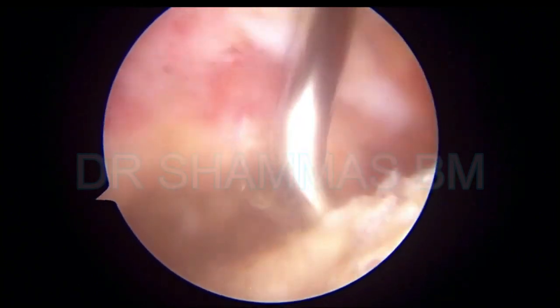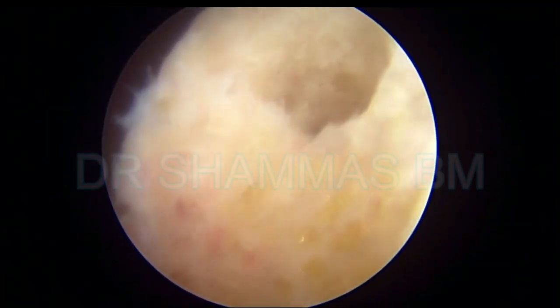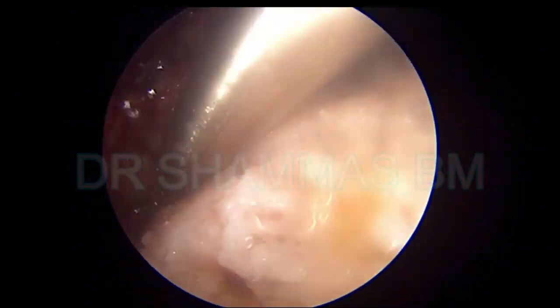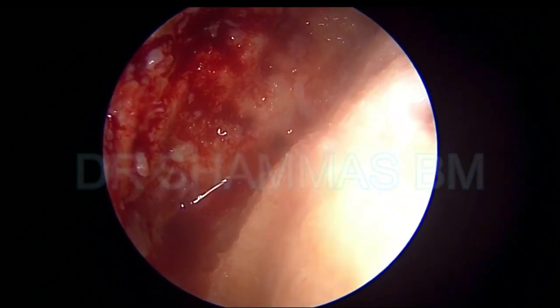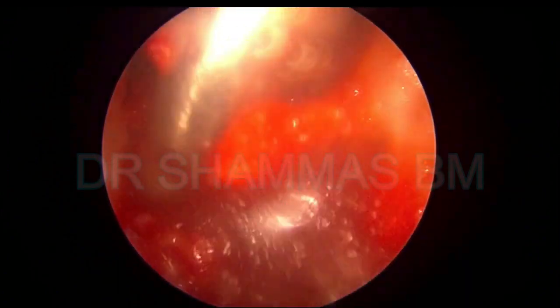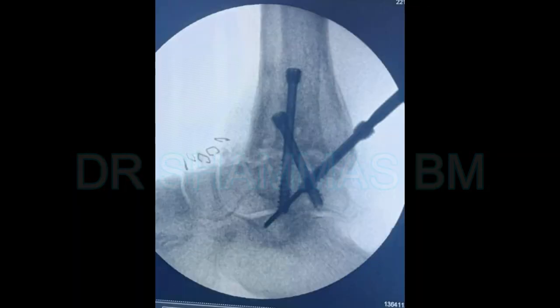After using the chondropic, you should stop the irrigation and do a dry arthroscopy, and aspirate all the water from the joint. The irrigation has been stopped and the water has been sucked out. Now graft has been prepared from the iliac crest and made into small pieces, and it is being kept inside the joint. This is done through the small arthroscopic hole — I have made the incision at the instrument site portal a little bit bigger. Through the scope I am visualizing the filling of the gap with bone grafts. After that we are introducing the screws.